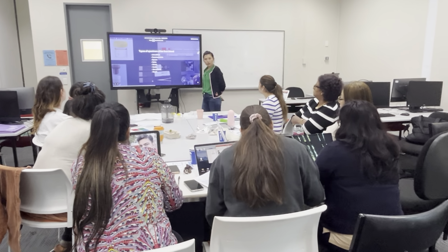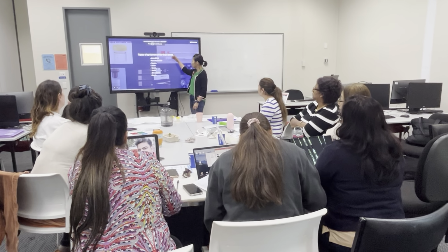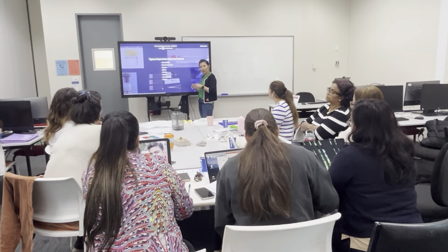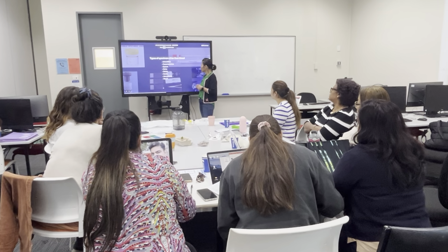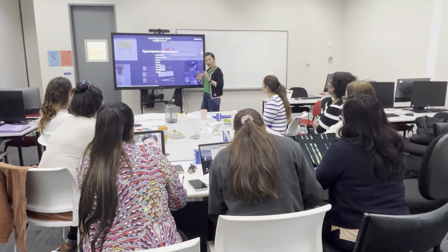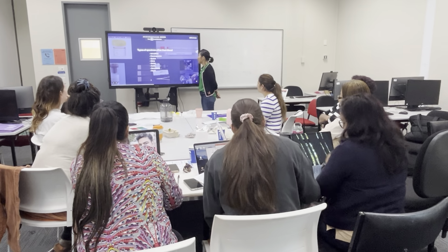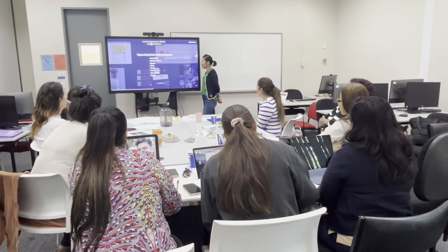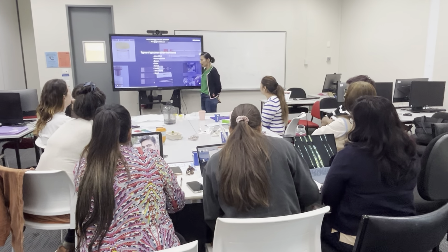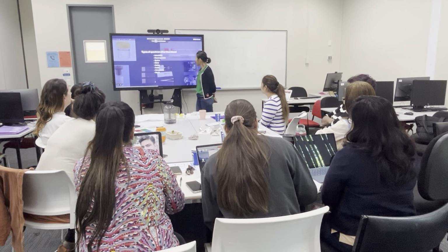So there are lots of types of specimen. You will probably see this specimen 90% of your life working as a phlebotomist or pathology collector, which is urine and fecal. We're going to teach you how to collect urine and fecal specimens. Don't be scared, okay? And there's one type of specimen you will probably come across quite often if you're working on the side with the laboratory on site, which is semen.